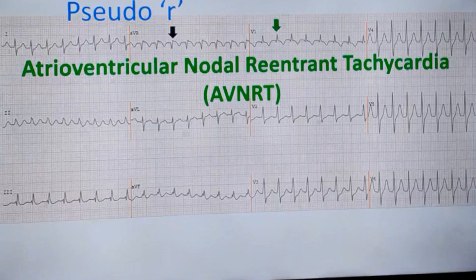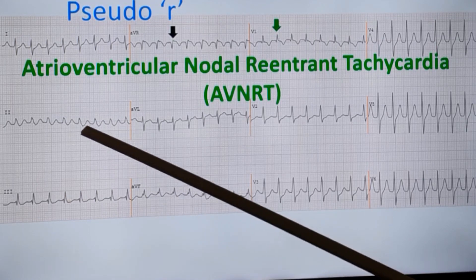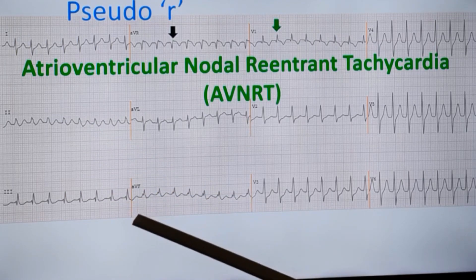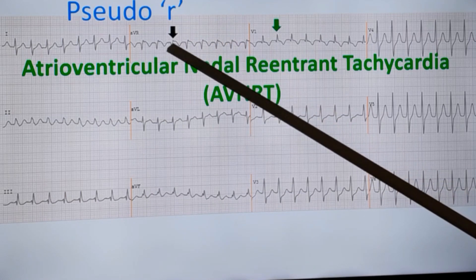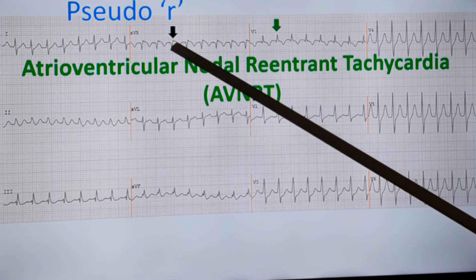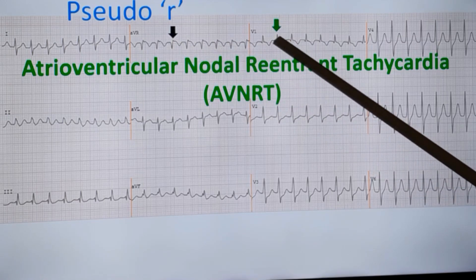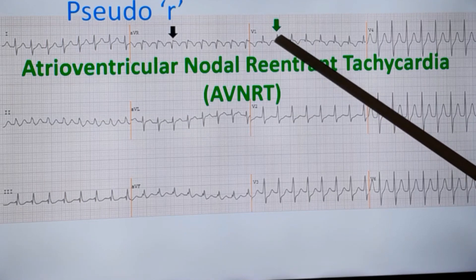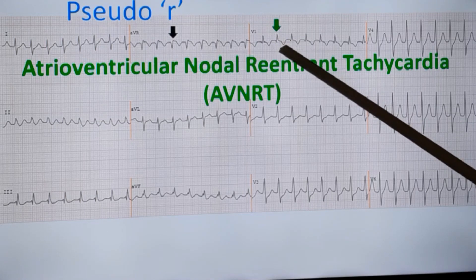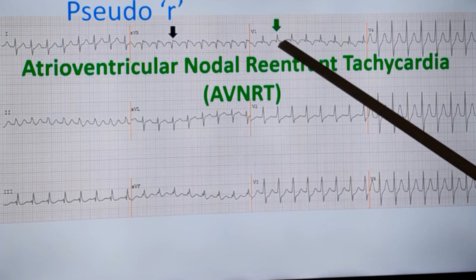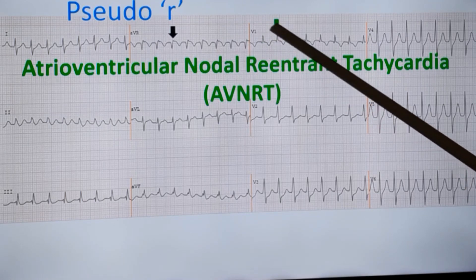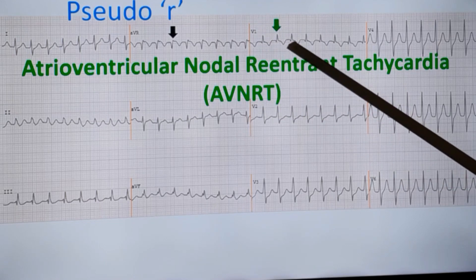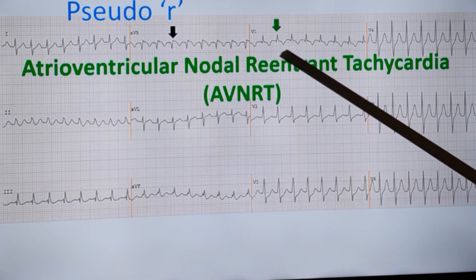We have seen the pseudo-S waves in inferior leads. Correspondingly, there could be pseudo-R waves in other leads. This is a pseudo-R wave — a small, positive wave. It is again a retrograde P-wave. In V1, this R wave is too tall to be called a pseudo-R wave; the pseudo-R wave may be within this R wave. But this tall or relatively tall R wave is unlikely to be due to a retrograde P.